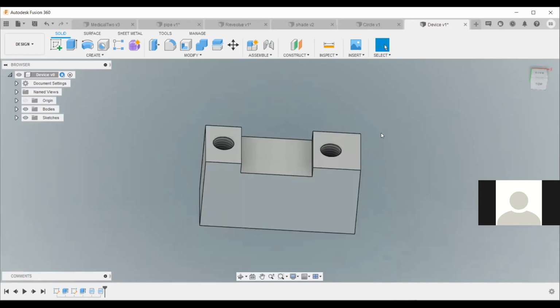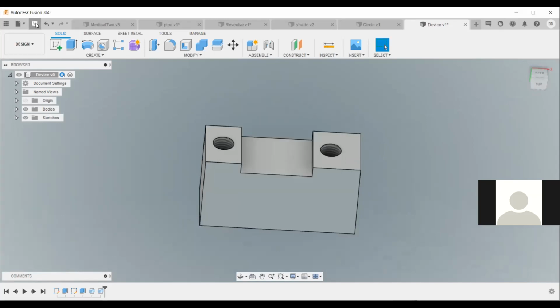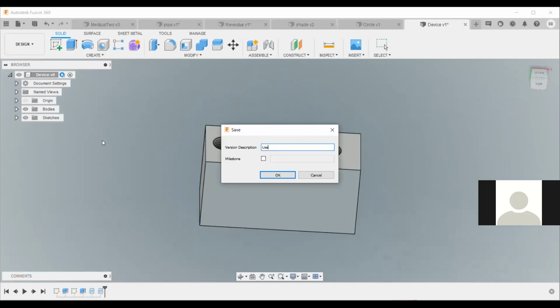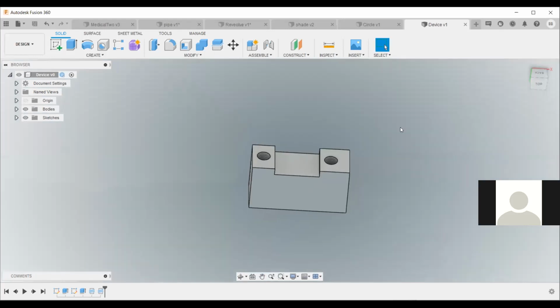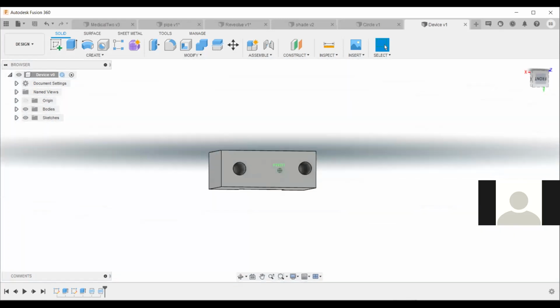So guys, save this as part 1, Control S, or File, Save as part 1. And the appearance, all those you can change. We had already shown you, you can do all those. Mmeona sasa? Mmeona hiyo?